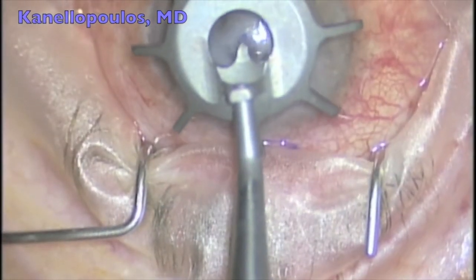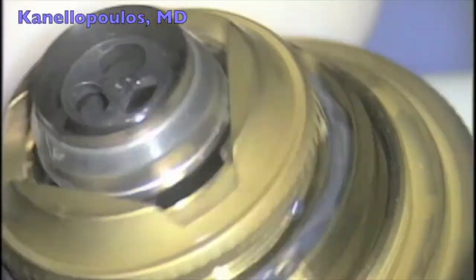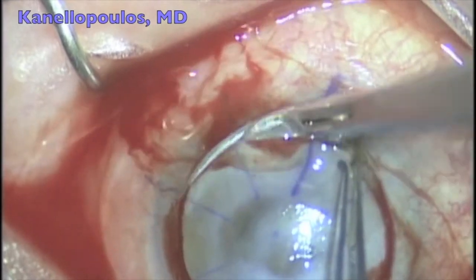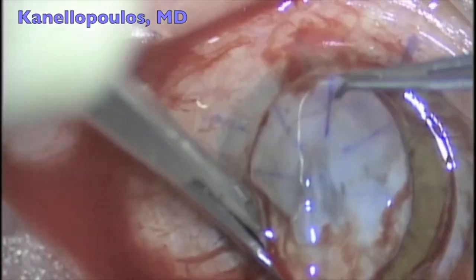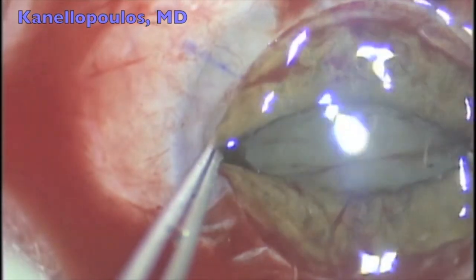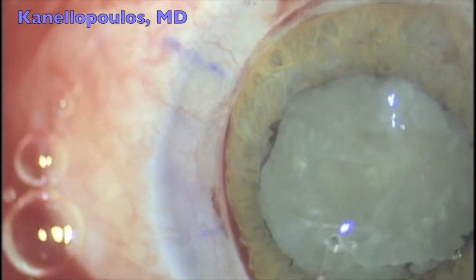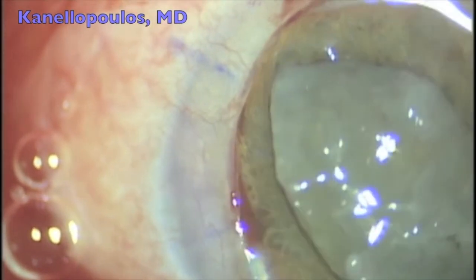Closing here, I'll show you a typical case — severe external disease. We're using a 9mm blade here with the HANA trephine. You can see the extreme external disease, a failed graft already twice, and coming in excising the cornea. We have a dense cataract underneath, so we're going to do an open sky cataract procedure: first a can-opener capsulorrhexis, and then with irrigation express the very dense cataract, as you can see here.